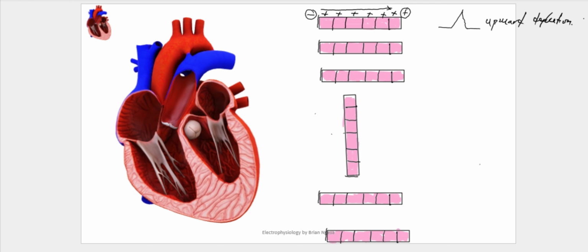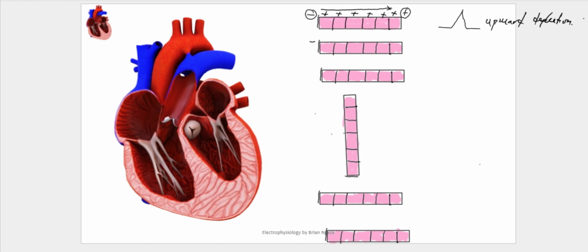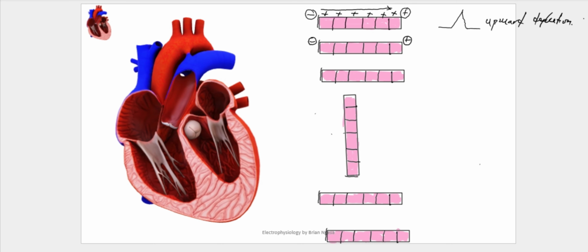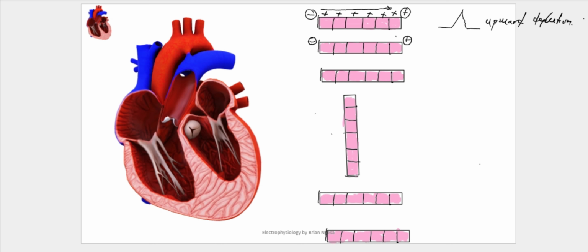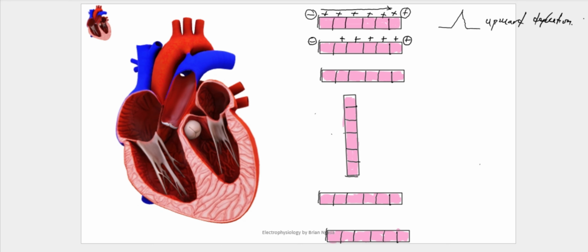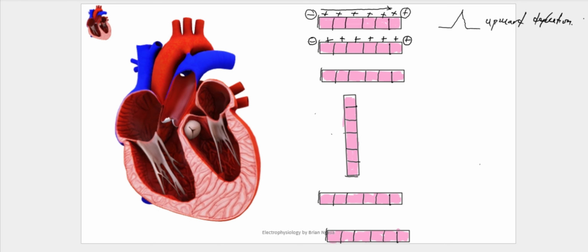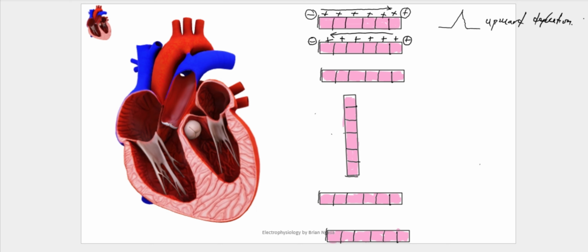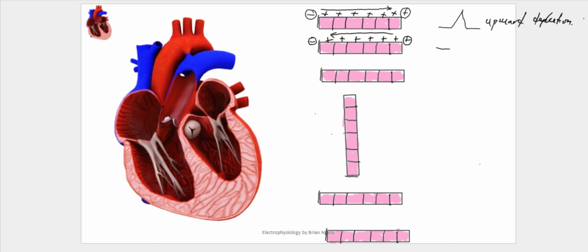Still, maybe with the same piece of heart muscle, you can decide still to place maybe a negative electrode in this area, your positive electrode in this area. But this time round, you are having an action potential starting in this cell, spreading in an opposite direction. So I want us to note this and not forget. This will be like our key, so that the wave of depolarization spreads from the positive to the negative. In the ECG machine or in the EKG, what we will anticipate is a downward deflection.